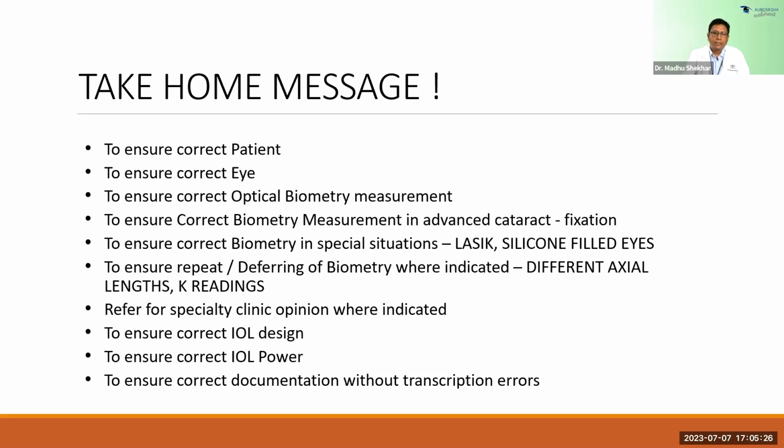So the take home message is to ensure correct patient, correct eye, correct optical biometry measurement, correct biometry measurement in advanced cataract where fixation is not proper, and ensure correct biometry in special situations like post-LASIK patients, silicon oil filled eyes, and retinal detachment surgery eyes.